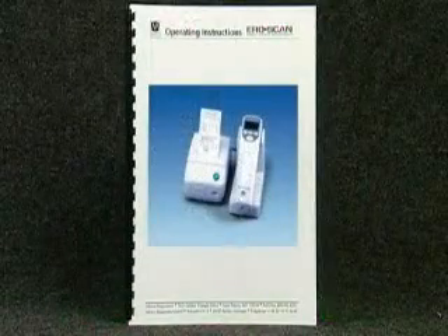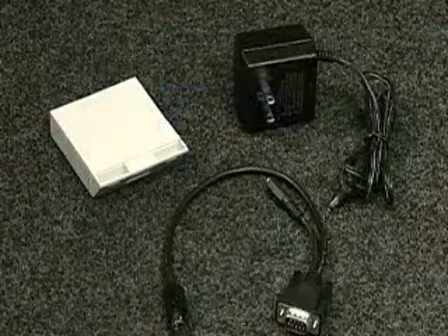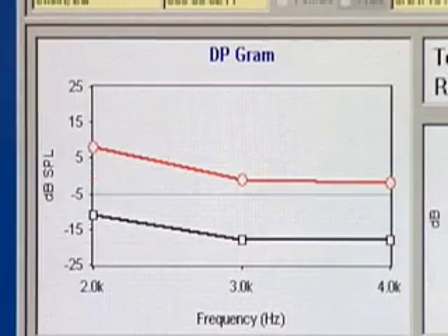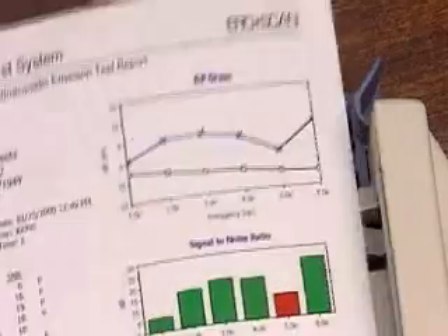Your system may also include one or more of the following: a carrying case, a rechargeable battery, and operator headphones. Also available is the AeroScan database software. This software allows the user to archive, display, graph, and print test results for each patient.